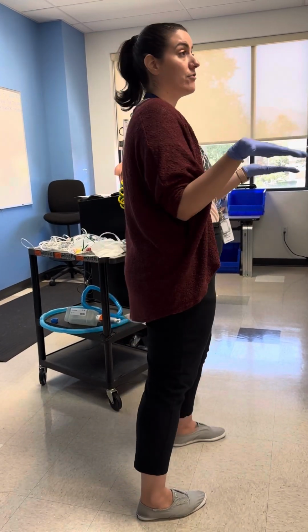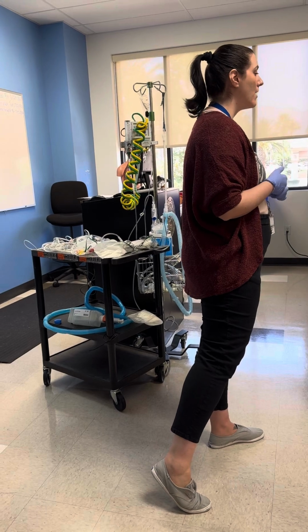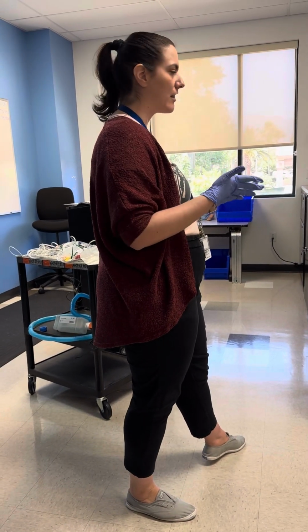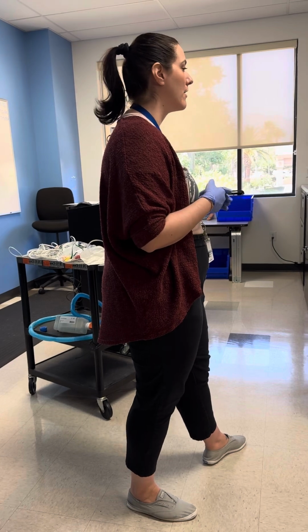So if you made that decision on nasal cannula, your education might look something like this. All right, Mr. Lennon, so the doctor called me to bedside to give you some oxygen therapy. I brought in something called a nasal cannula because the nasal cannula gives kind of a low flow. I'm looking at your values. Looks like your numbers aren't too bad, so we're going to give you something that should be pretty easy to use since you're not in a very exacerbated state.